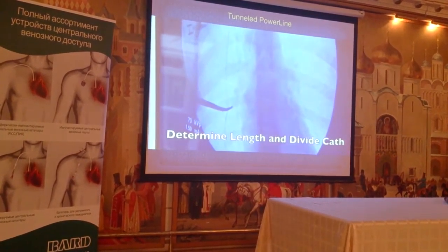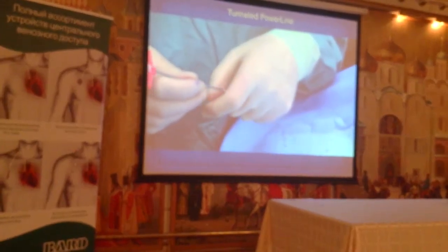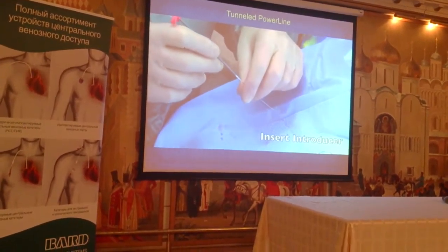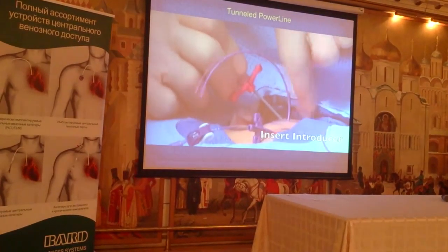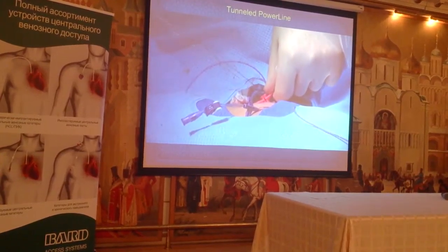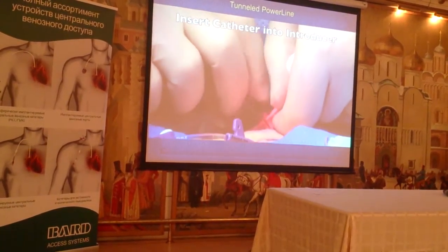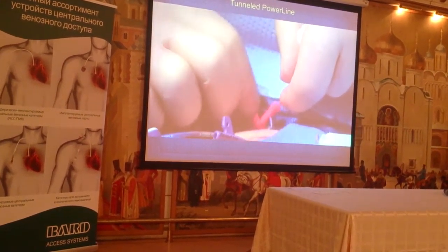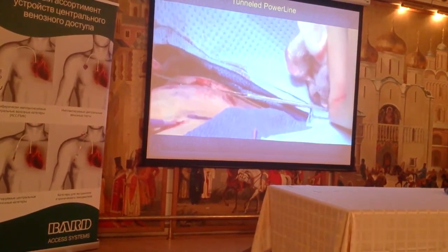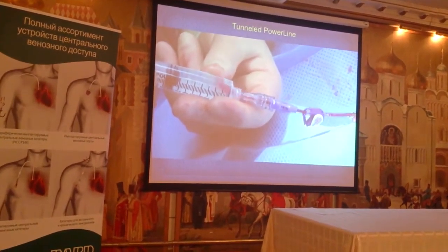After we do that, we determine the length needed for the catheter. Then we put the introducer over the guide wire down into the jugular vein, insert the catheter through the introducer, and break off the peel-away sheath — it's a standard technique. There's our catheter down at the caval-atrial junction.